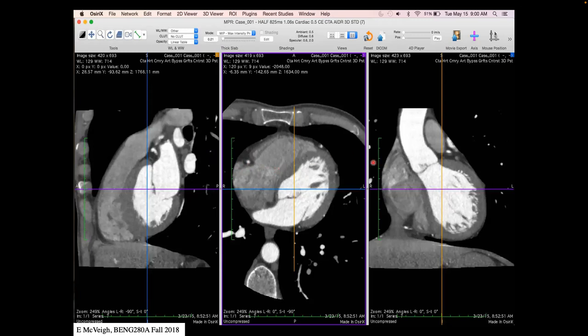Three perpendicular cuts through the patient's heart are shown. The axial view — looking from the patient's feet toward their head — shows the sternum, lungs, spine, descending aorta, and the standard left-right orientation. This is the standard view you don't flip around, though there are rare genetic conditions where all organs are mirror-imaged.